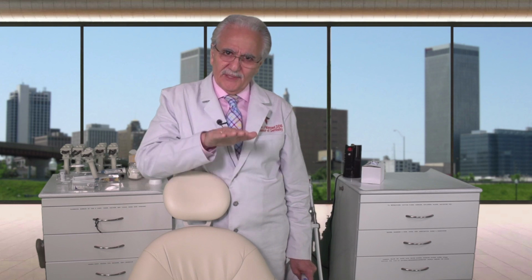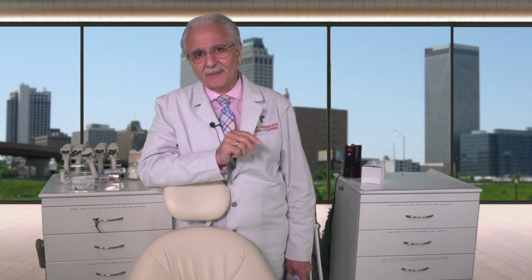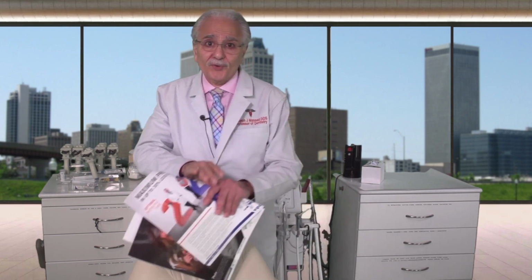And then I'm thinking, well, I need to really drop these down. And then I look and there's no room. And that's because we did not measure the space prior to implant placement. It's a definite thing that we all need to do.